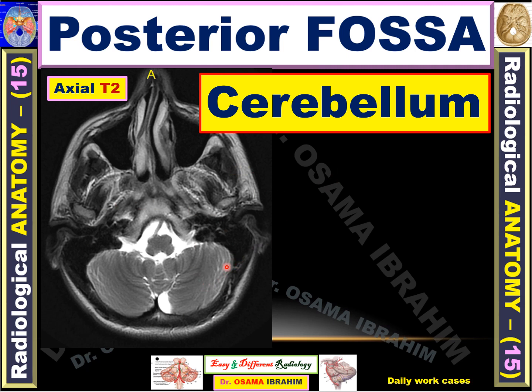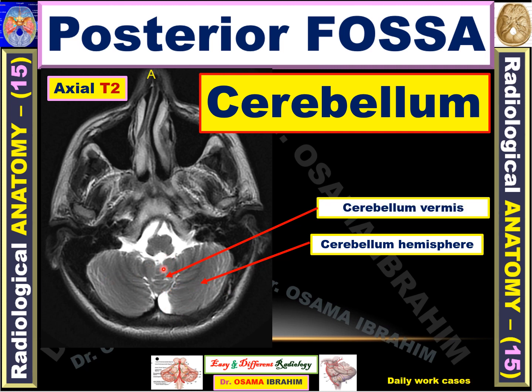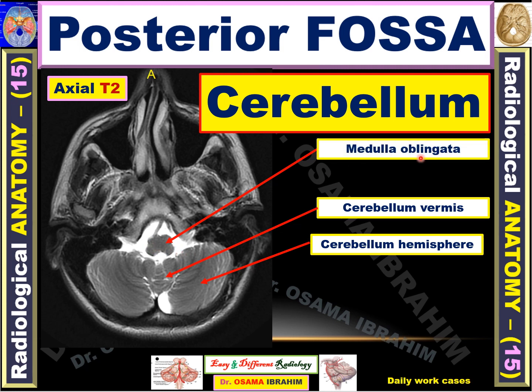What are the contents of this posterior fossa? On this axial T2-weighted MRI image — where CSF appears bright and subcutaneous fat appears bright — the cerebellum appears on both sides as two cerebellar hemispheres. The left cerebellar hemisphere is visible, connected to the right by the cerebellar vermis. The anterior structure is the brainstem, and this part is the medulla oblongata, which is the most inferior part of the brainstem.